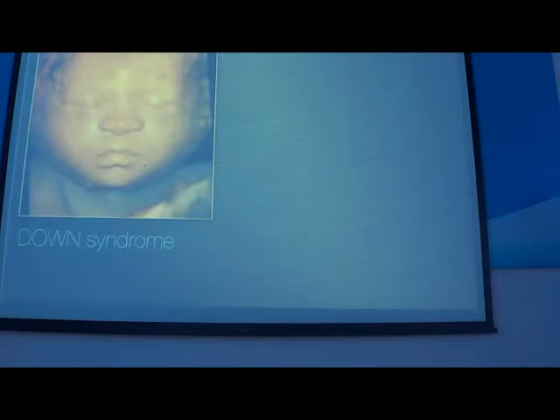Normally the size of the mouth is greater than the size of the nose.